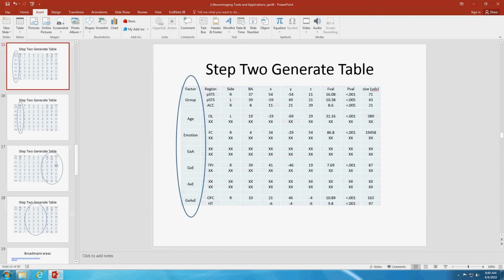Another thing people do sometimes is, if they have a specific thing they are really interested in, like the face, which is where I see people do this a lot. There's a face area, so you will do a localizer. For every person, you start with a whole bunch of faces, a whole bunch of houses, and you find an area in this general region where each person has the peak activation, and this is their fusiform face area. Then you take that data out and pull it into all the different analyses, and you don't really worry about doing these group level things. If you have a question that's really tight like that, that's probably the best way to do it.